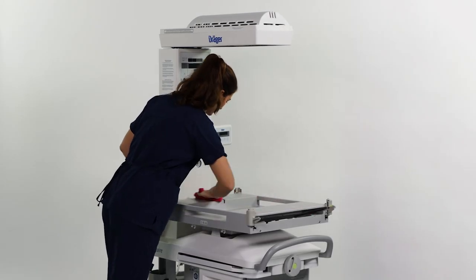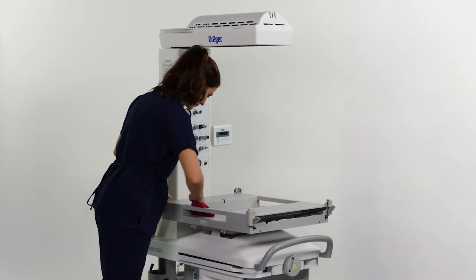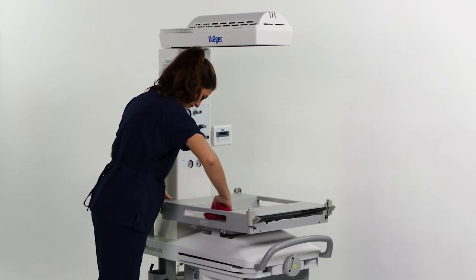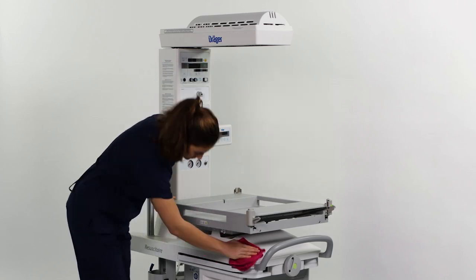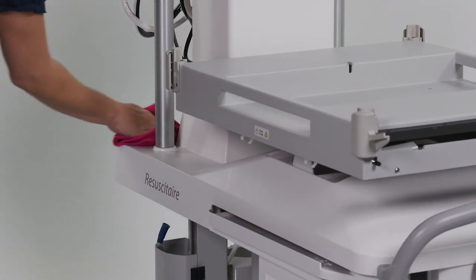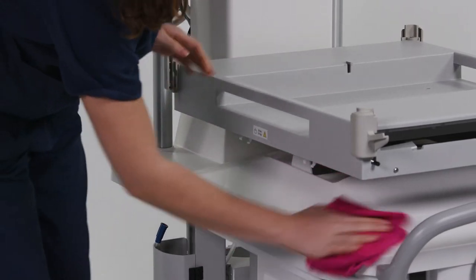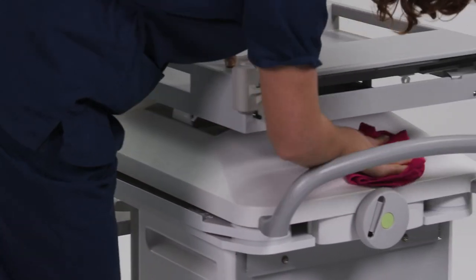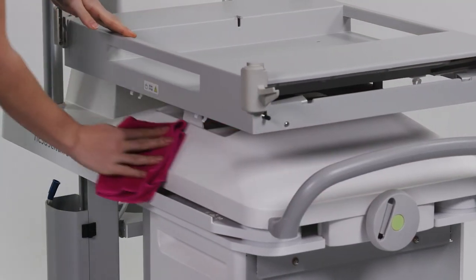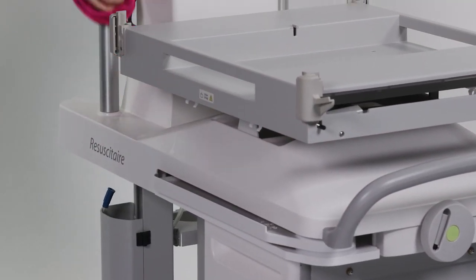Resuscitaire is a non-critical medical device, and the corresponding risk should be considered. Surfaces accessible to users and patients should be disinfected by wiping. Do not steam clean the Resuscitaire. Manual disinfecting is most effective. When disassembling the device, use recommended disinfectants. Refer to the IFU or supplements for the approved disinfectants.